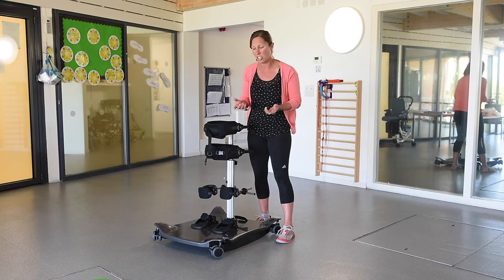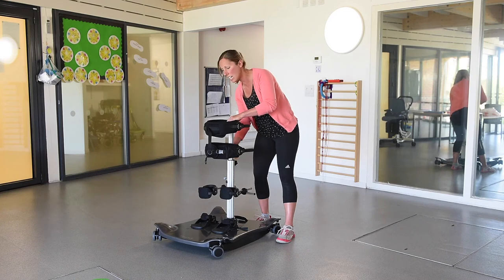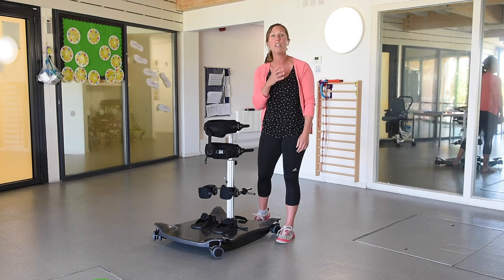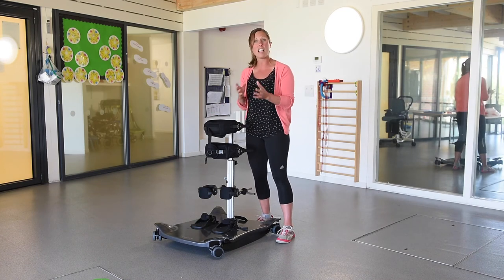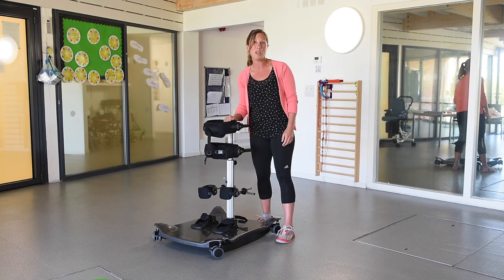As their point of instability changes, it's really quite simple and easy to adjust. You can adjust the height really easily — these just move with one allen key, easily up and down. So it's quick and simple to adjust, and you can change that to meet the needs of each child. And that's my hints and tips on using the Meerkat.